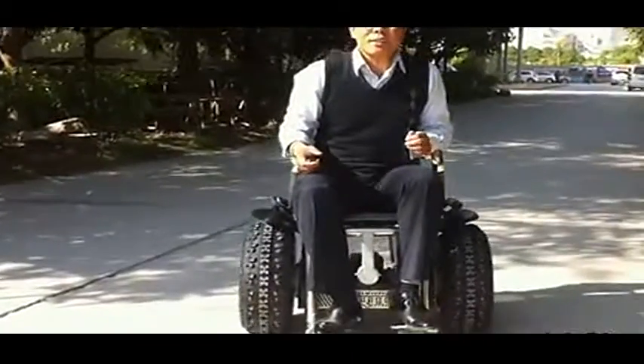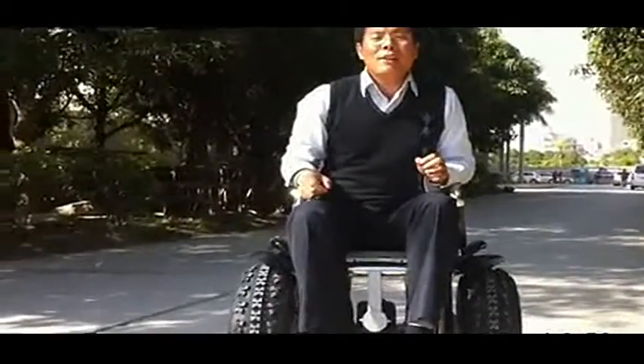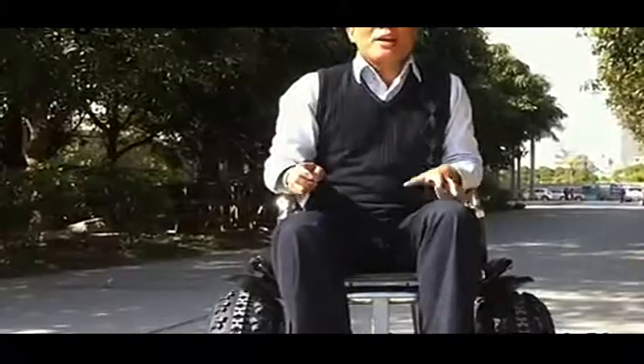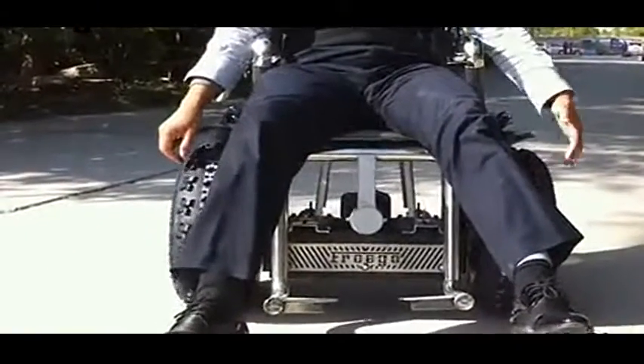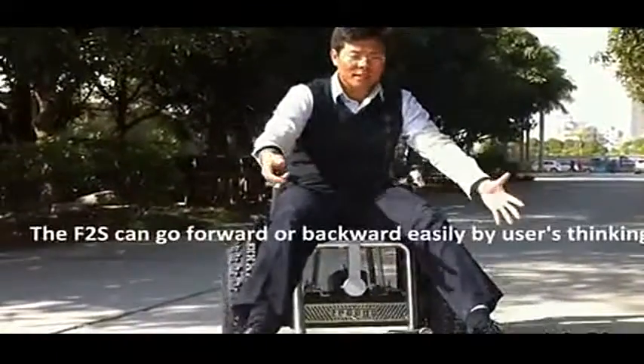As you see, it's an electric wheelchair, but it's self-balancing. Totally different than the traditional wheelchair we have seen. There are only two wheels, not four wheels. The traditional wheelchair has four wheels, but ours is only two wheels. But it can keep balance — you see, like this? It's balanced.